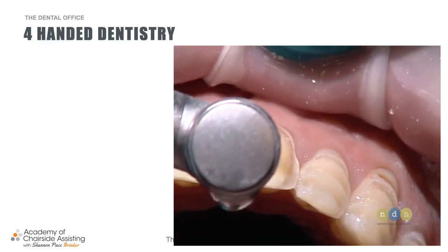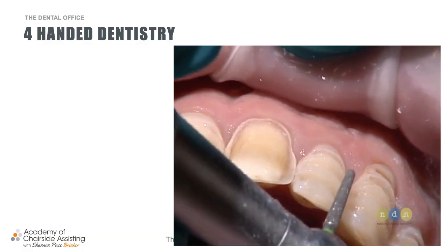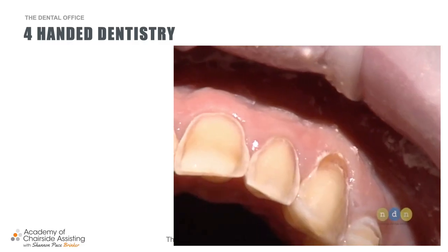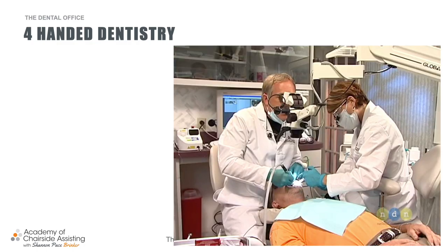Notice where I've got my air water and I'm holding the suction in my right hand. I'm constantly going in and out. You see where I am. I will go wherever I possibly can sometimes. This is called the Tipadilly. It's basically a curved suction, and this is a great option for those of you that are especially new assistants.